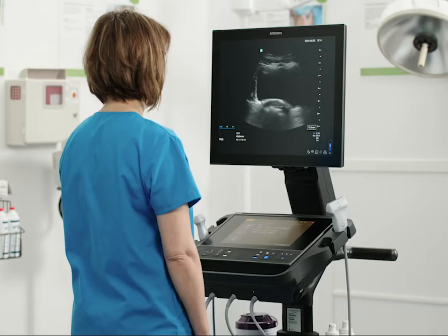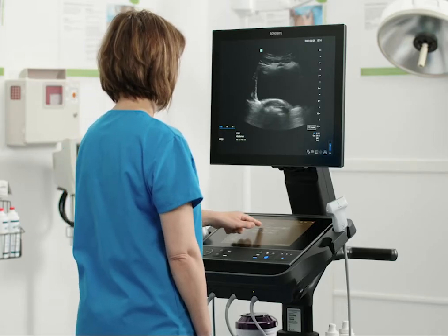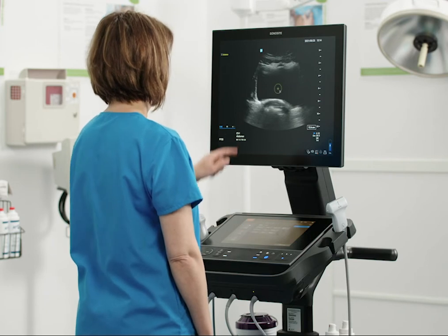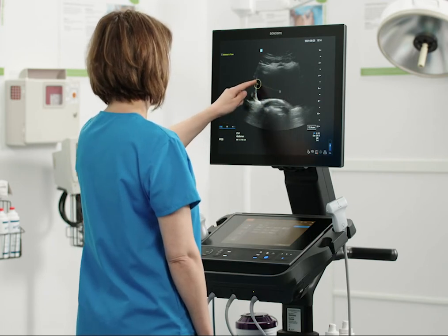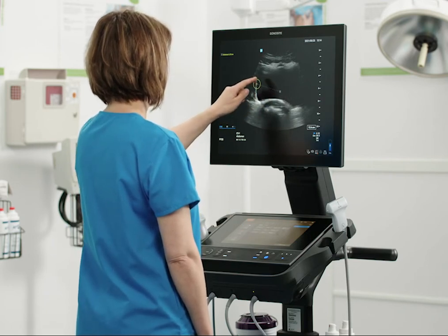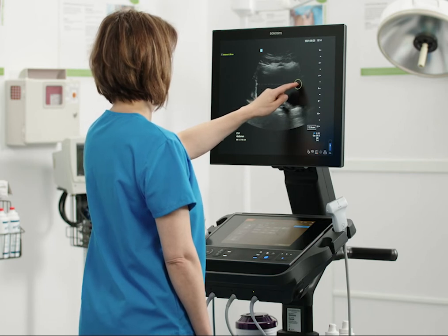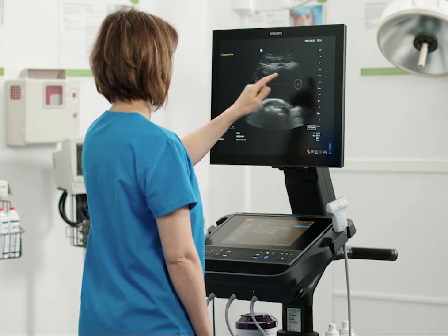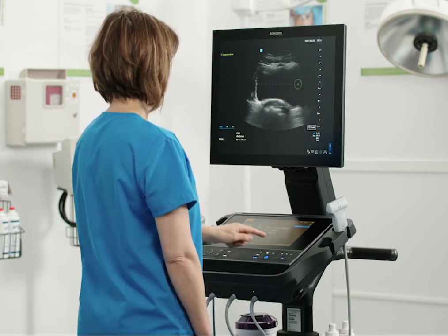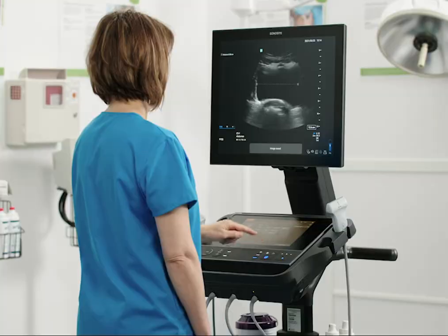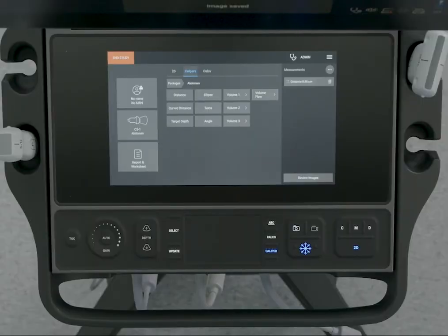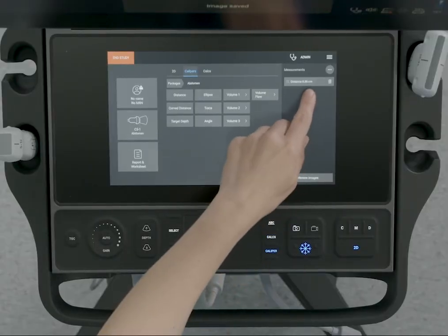Let's walk you through a distance measurement. Track the active caliper to the start of your measurement. Press the select button or tap it on the clinical monitor to activate the other caliper. Now you can position it at your endpoint. You will see the measurement appear in the results sections of the touch panel and the clinical monitor.